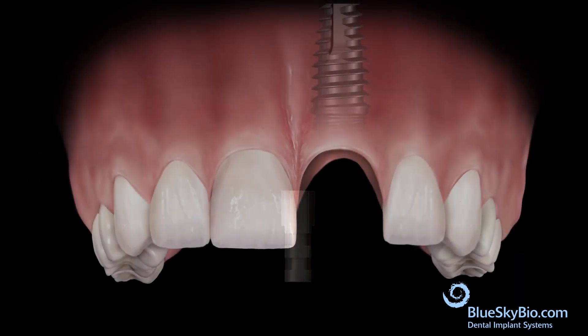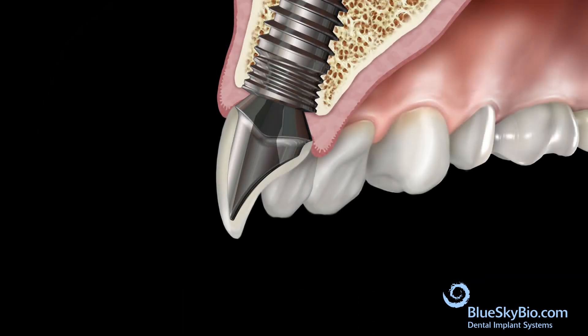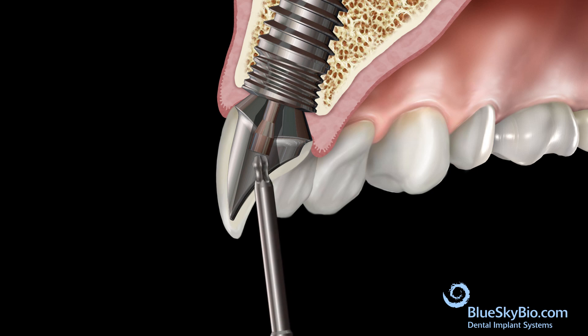Remove the restoration from the analog and place the restoration in the mouth. Tighten the fixation screw with an angled driver. The screw should be torqued to 30 newton centimeters.